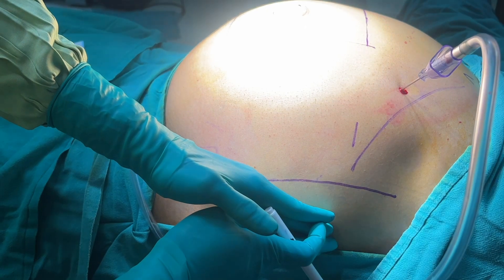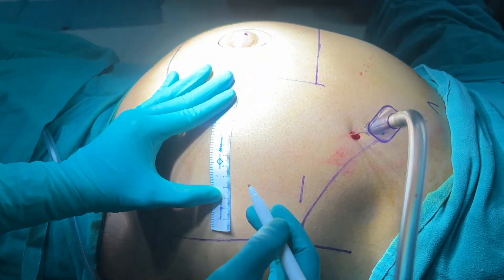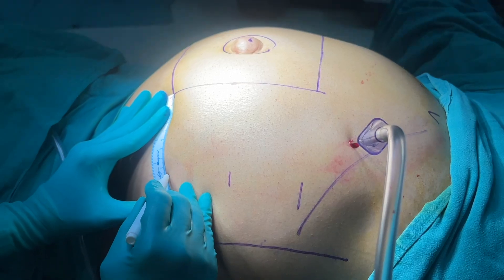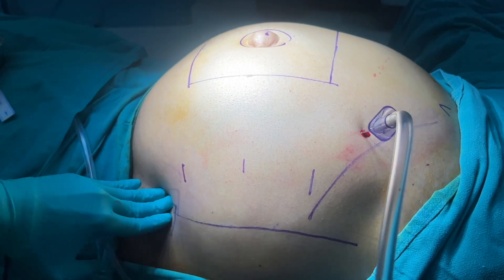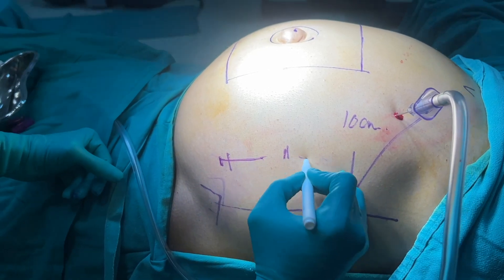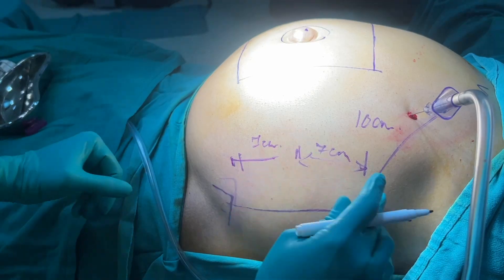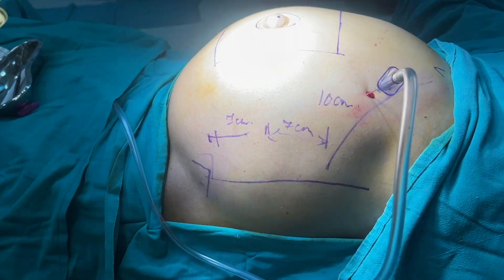This is the anterior superior iliac spine, and a rough marking of the anterior axillary line — we normally tend to be proximal to it, meaning the limit of port placement should not go beyond this line. The camera port is at the level of the umbilicus and the third port is placed accordingly. The distance between our ports is 7 to 8 centimeters and we are almost 10 centimeters away from our planned line of incision.